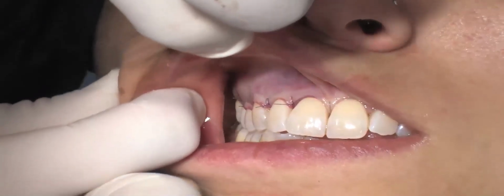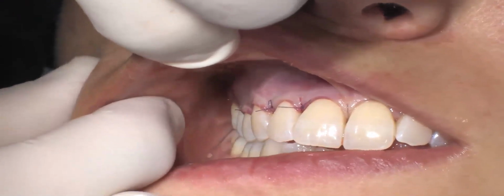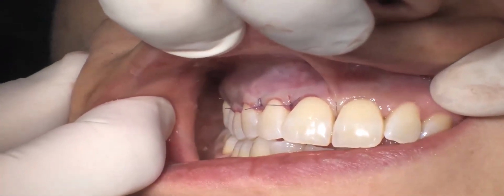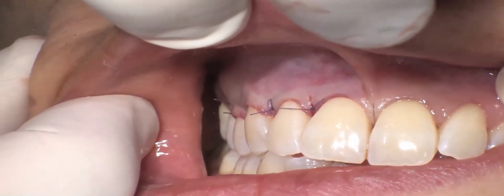Okay, if you pull the lip, there is stability of the soft tissue margin and the blood clot is going to be stabilized above the root. Okay.